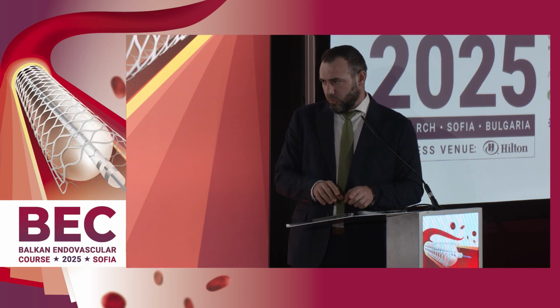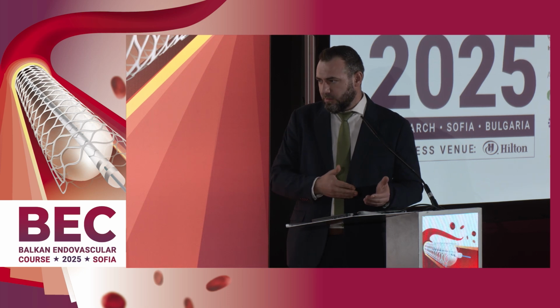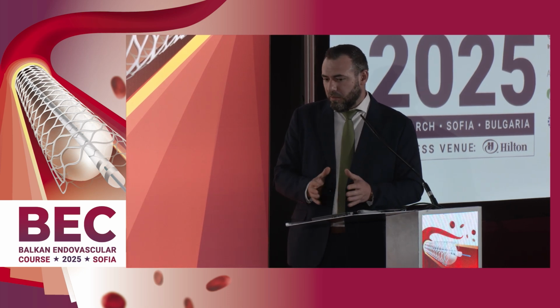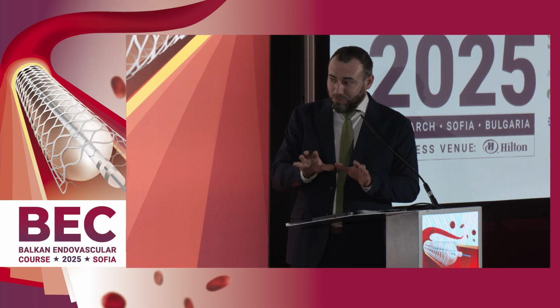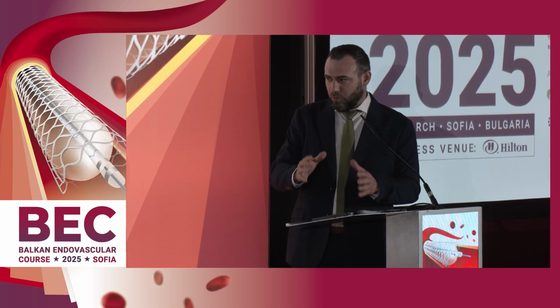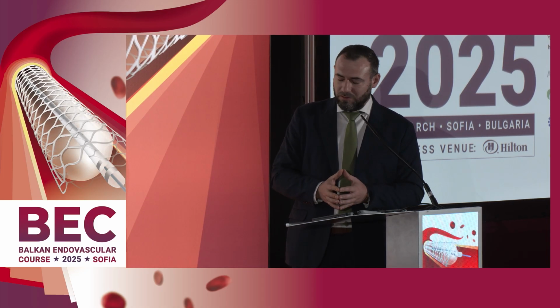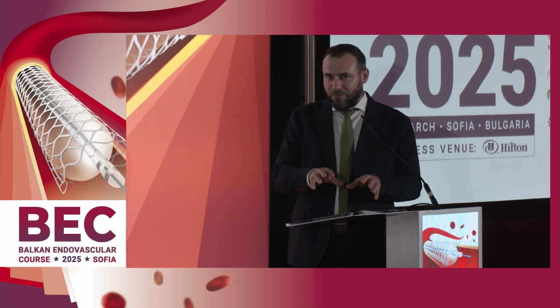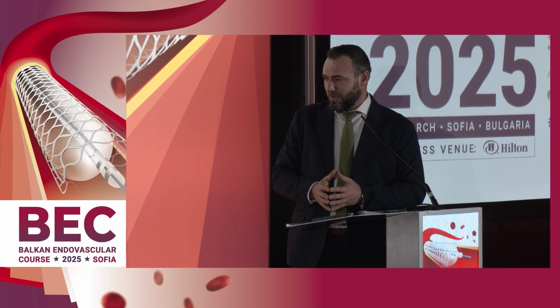If the patient is not stable, we are deploying the balloons. We have all of the access. We can exclude literally the aneurysm, but in the first case that didn't happen because the anesthesiologists did the work to have a normal blood pressure in the patient.